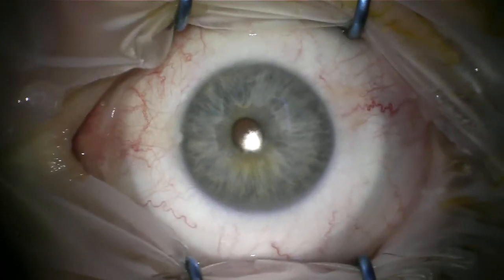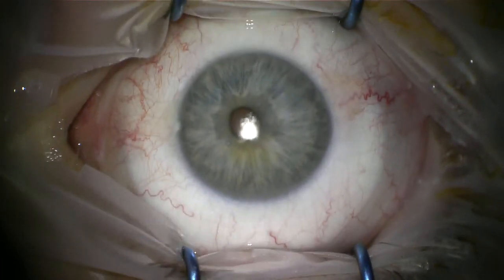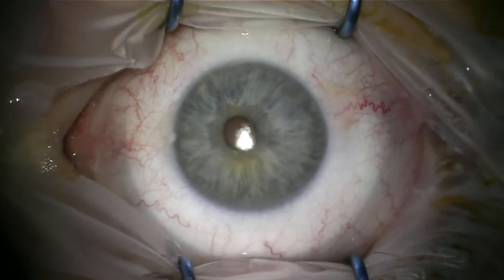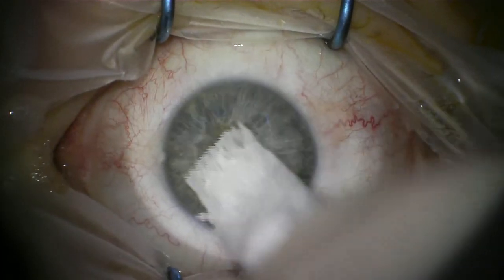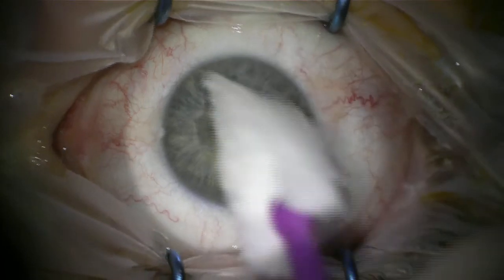At the start of the procedure, you need to wipe the patient's cornea three times horizontally and three times vertically with a BSS-soaked spear. This isn't the perfect video of me doing this — I took this from another procedure — but it does at least demonstrate a wiping of the cornea. This is really to remove the mucin layer from the surface of the cornea, and it allows better penetration of the riboflavin.